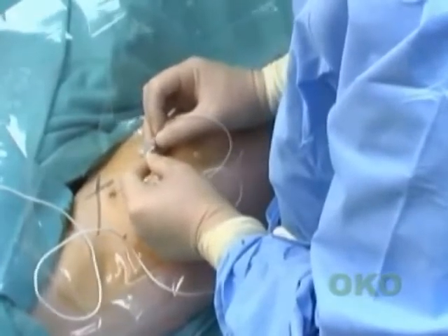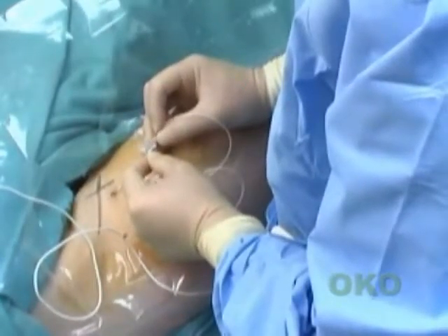If, however, the twitches disappear, carefully withdraw the catheter to inside the needle shaft again, such that the entire broad black mark is visible again. Make a small adjustment to the needle by rotating it 1/4 turn clockwise or counterclockwise, or by withdrawing or advancing the needle slightly and again advance the catheter. Repeat this maneuver as many times as is necessary to ensure correct and accurate catheter placement and successful secondary block.